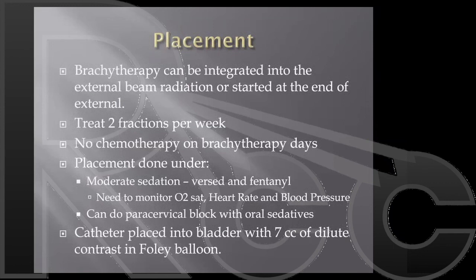So brachytherapy in patients with small tumors can be integrated into the external beam radiation therapy. We do that occasionally. We may give the patient 4 external beam fractions and then on the 5th day give them a fraction of brachytherapy. But normally we start at the end of the external beam as soon as possible after the last treatment. We treat 2 fractions per week. We don't allow chemotherapy on brachytherapy days, but normally patients have completed chemotherapy by the time they start their brachytherapy.